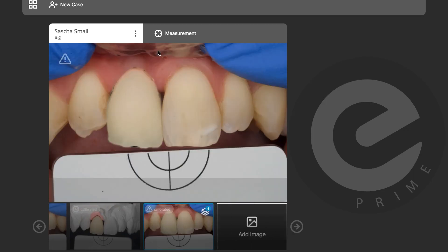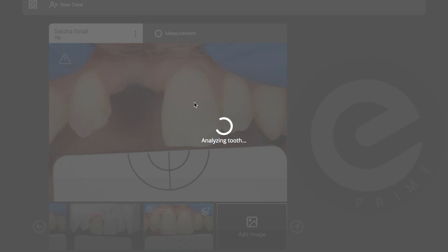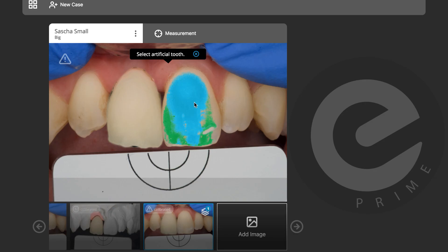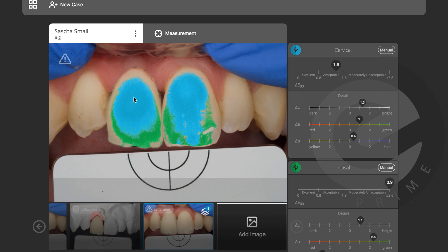This is my first digital try-in. Now I can do the measurement — select the tooth, select the natural tooth first, it does a quick calculation, then select the artificial tooth. This is real magic: now I can compare these two teeth together.